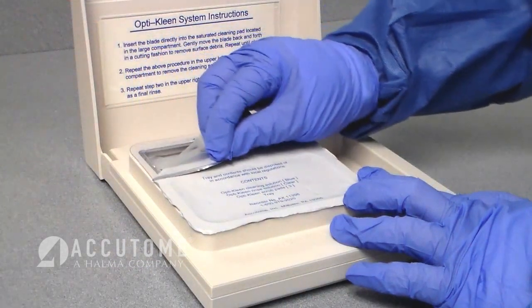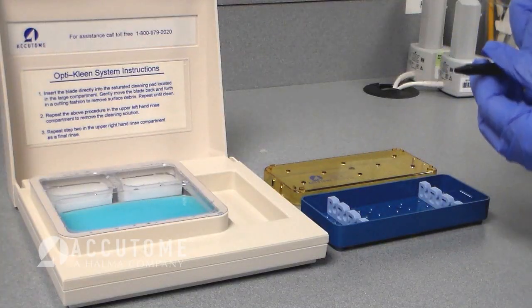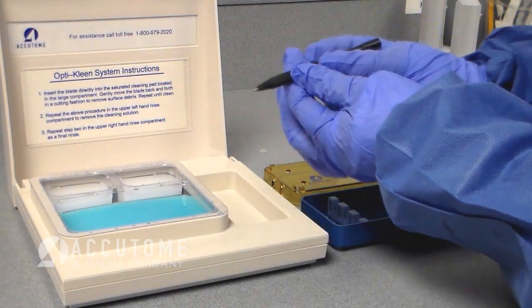Next, peel back the top cover on the OptiClean blade cleaning system, remove your diamond knife from its tray, and expose the blade for cleaning. Vertically insert the soiled blade into the soft blue scrubbing pad.